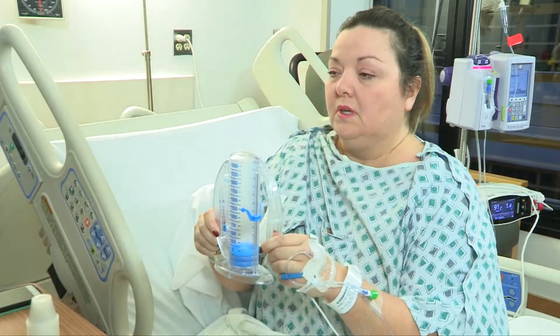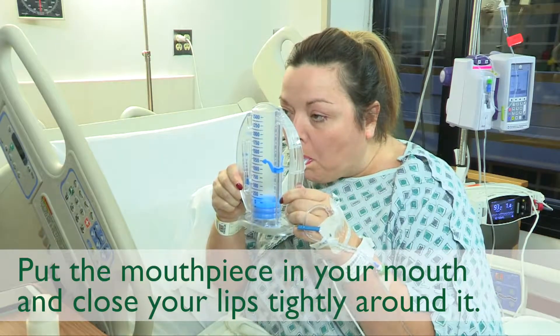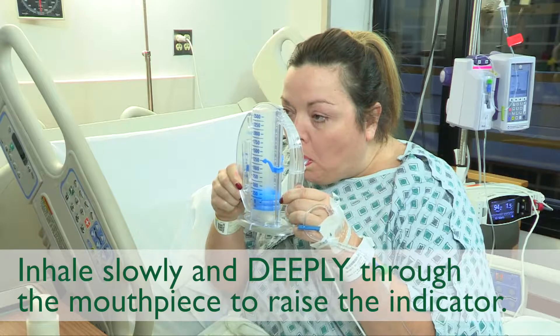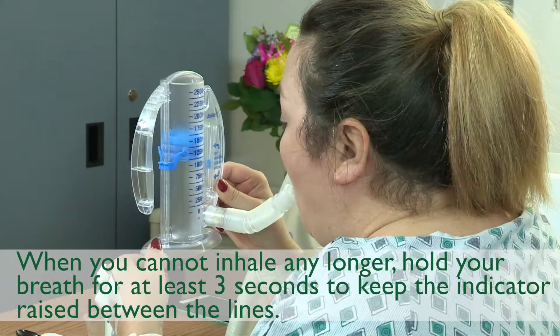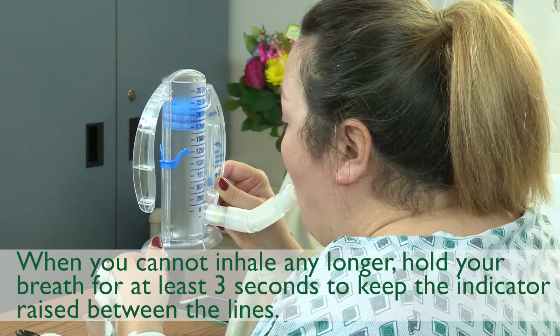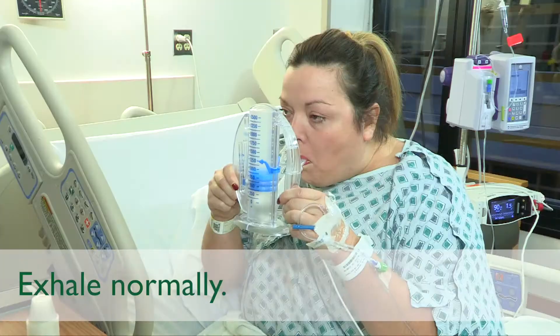Exhale, breathe out normally, and then do the following. Put the mouthpiece in your mouth and close your lips tightly around it. Inhale slowly and deeply through the mouthpiece to raise the indicator. When you cannot inhale any longer, hold your breath for at least three seconds to keep the indicator raised between the lines. Exhale normally.